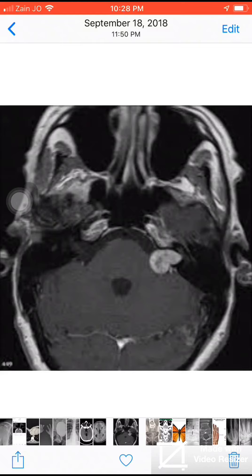The mass extends outside the canal, and this is a classic case of acoustic neuroma, arising from the vestibular nerve. It is also called vestibular schwannoma. If bilateral, it is classic for neurofibromatosis type 2.